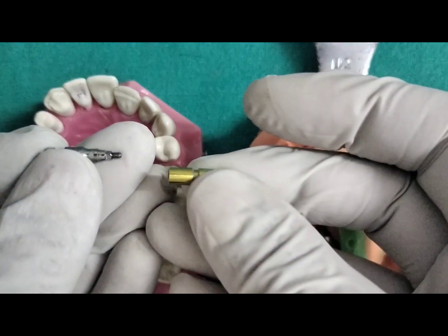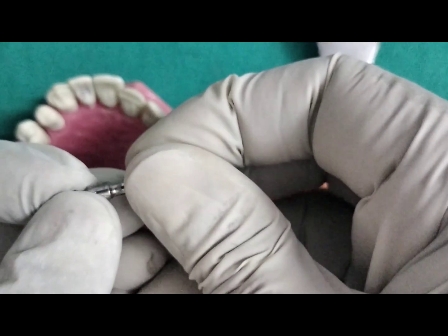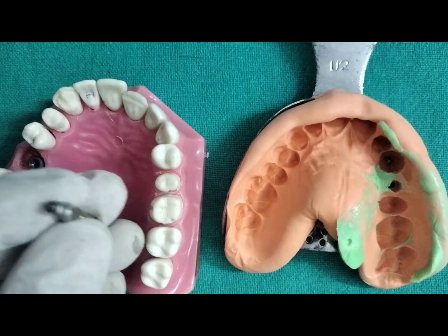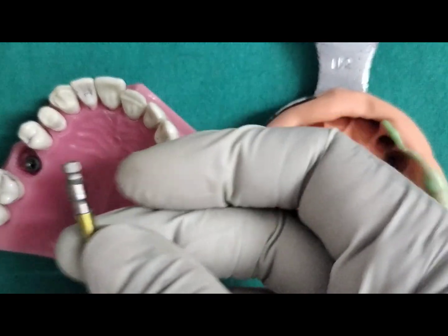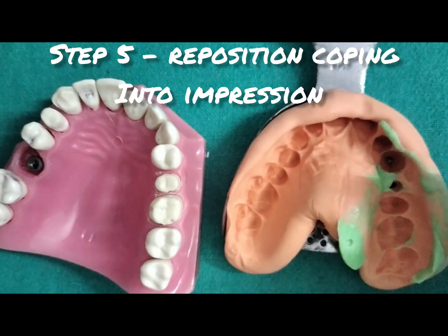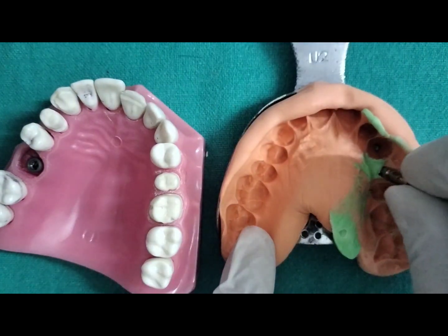So we have the impression coping and then we have the implant analog. Just screw it and this becomes one assembly. Now place this assembly accurately over the implant impression. Position this, make sure that you position correctly.